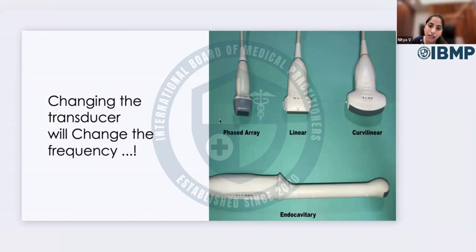First of all, the phased array probe. They're used as high penetration probes, in intercostal imaging and cardiac imaging. Then the linear probes, which are used for superficial scanning, such as bowel scanning, the thyroid, other superficial structures, and breast ultrasounds. Then the curvilinear probe, which is the most usable probe in ultrasound. That is used for abdominal scans, basically for the pelvis and the abdomen.